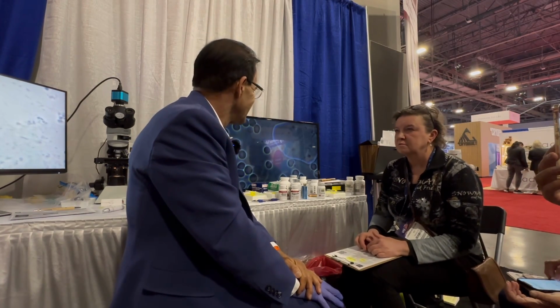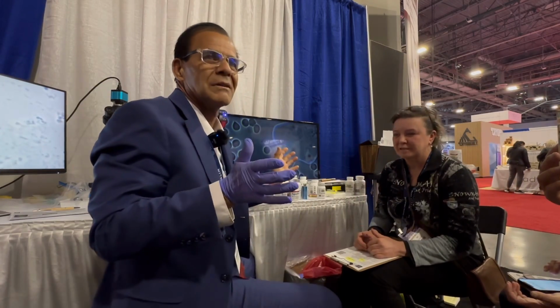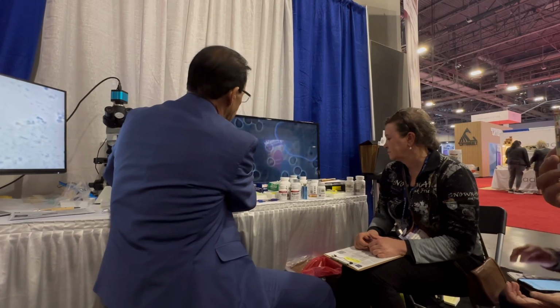Is that a water lipid droplet molecule? Lipid, no? It's just an air bubble. Air bubble. Okay, yeah. Discount it. You know, people will make up things that you're seeing and you're not.